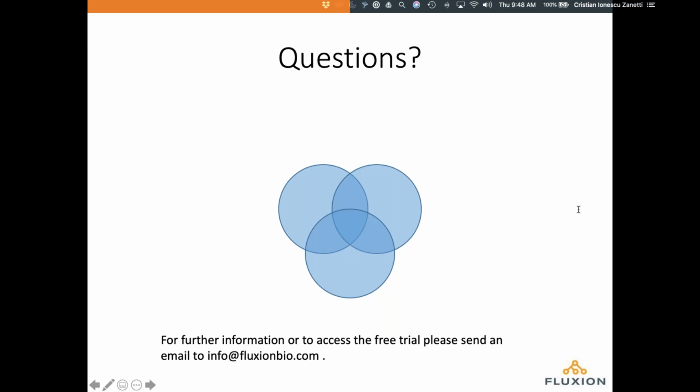And then there's a question about PCR duplication. Does PCR duplication affect the allele frequency calculation here? I think the answer to that is probably, but we don't take into account PCR duplication. If you're individually tagging molecules, you may have some understanding of the amount of PCR duplication. In this case, because we're using a panel, all of the starting molecules go into the same pool. So whether our variant comes from 1 or 2 starting molecules, we don't know, but we can tell with high confidence whether it's a significant presence or not of that particular variant.